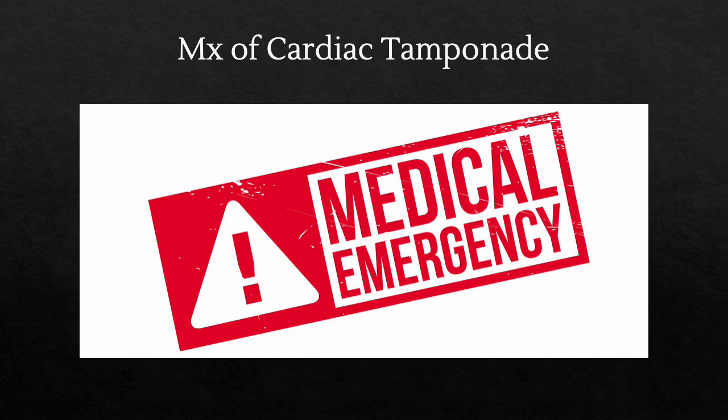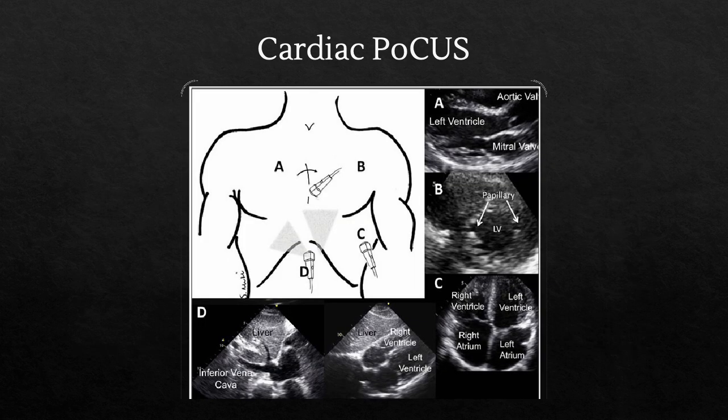Management of a cardiac tamponade is a medical emergency. It needs prompt action, and prompt aggressive action, actually. The first thing you will do is an echo in a patient. This is just a video showing what an echo will look like in a cardiac tamponade.